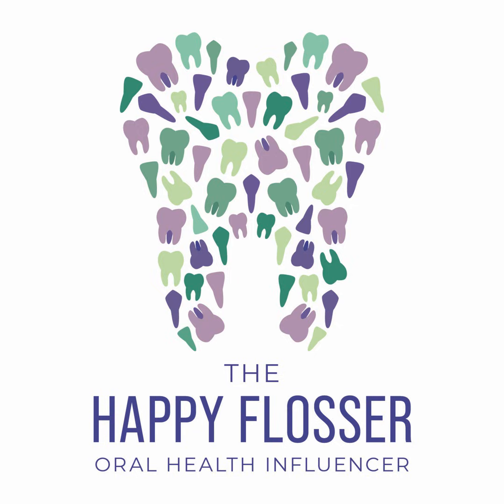I'm going to look for composite restorations, and we know there's so many variations in radiopacity for our composite restorations based on the age of our patient and when they had that composite placed. So I'll also be looking for crowns and bridges and implants. Maybe I'm looking to see if there's any root canal teeth or bases or liners around some of these restorations to help me focus on denoting if something is a restoration or pathology, right? So sometimes when you focus on those restorations, it helps you with identification.